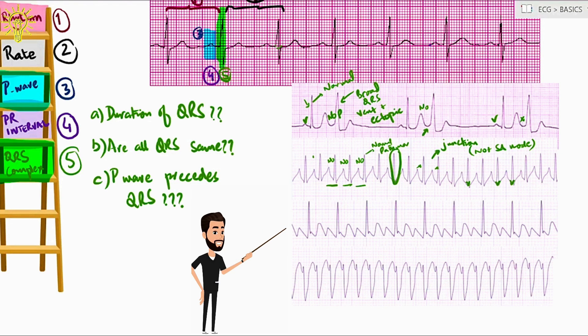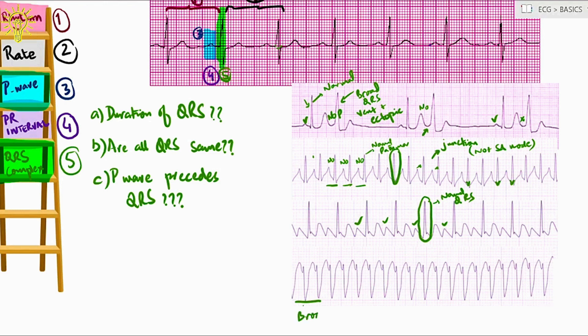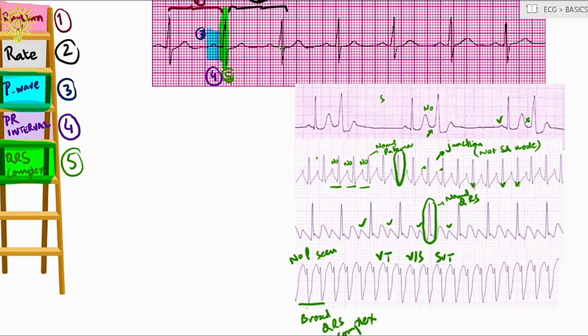Below is atrial flutter ECG. The flutter waves are evident and QRS is narrow. In the last ECG, the QRS are broad. I cannot see the P wave. It could be ventricular tachycardia or it could be SVT. How to differentiate, we will discuss in subsequent episodes.